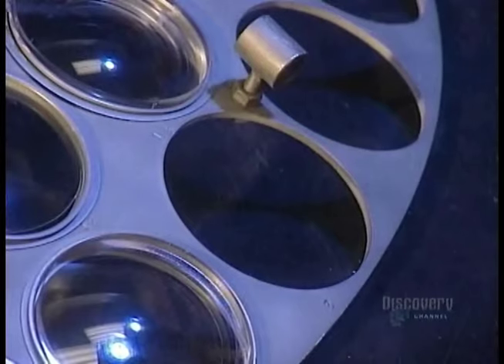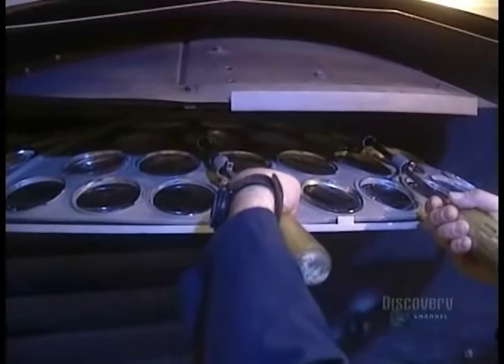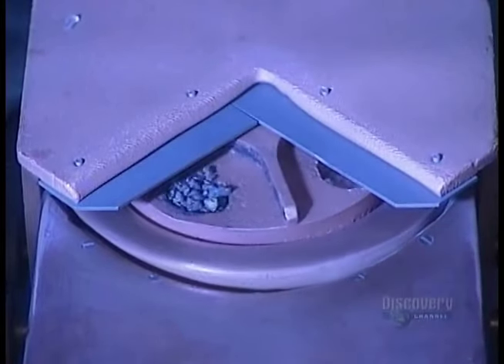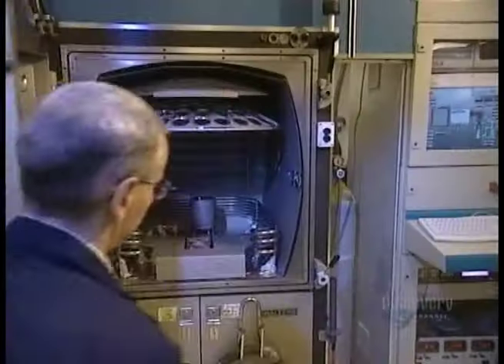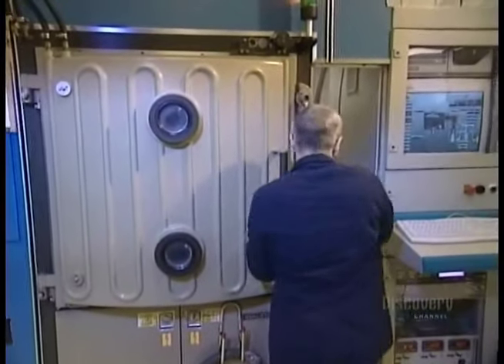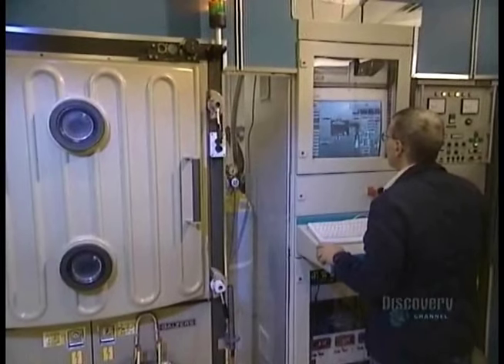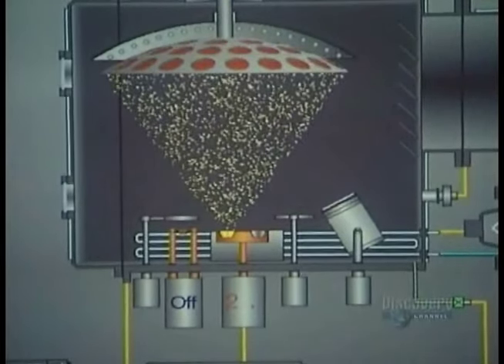Next comes the anti-reflection treatment. This will increase the lens's transparency, allowing in more light. The lenses go into a chamber. They add different powdered chemicals, such as silicium oxide, titanium oxide, and zirconium oxide. They close the door, then pump all the air out of the chamber. Using a high-powered electron beam, they heat the chemicals to the boiling point. The powders transform from solid to gas, coating the lenses in the process.